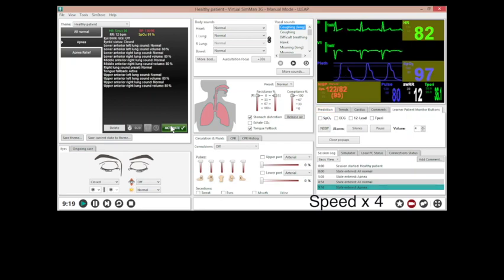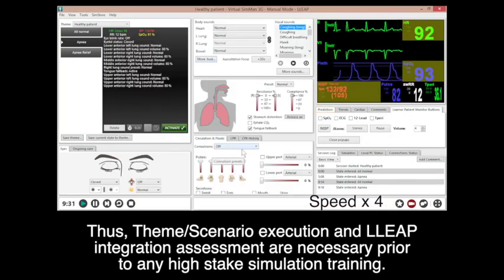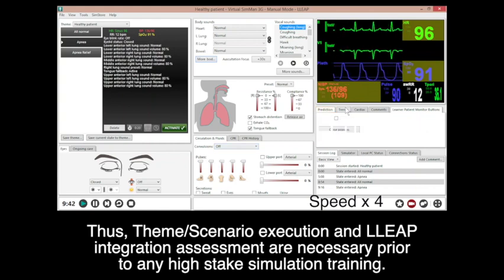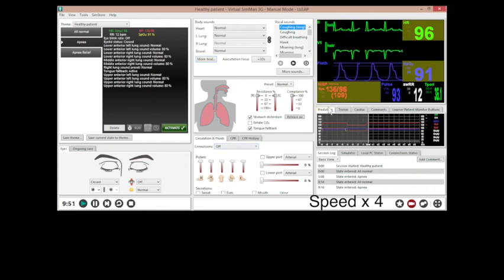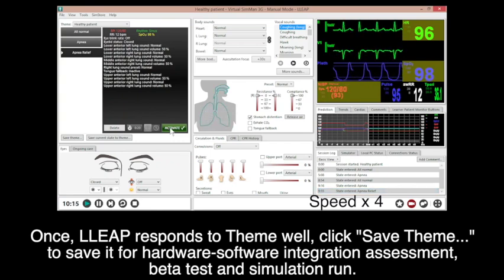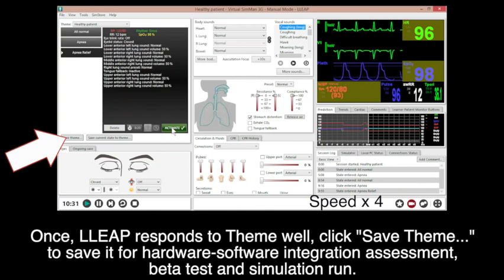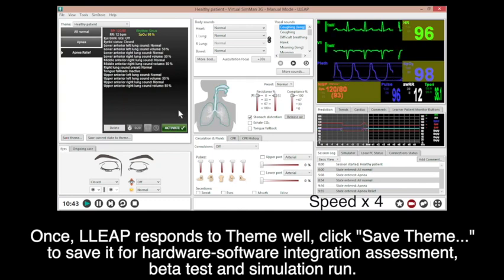Thus, theme and scenario executions and LLEAP integration assessment are necessary prior to any high-stakes simulation training. Once the theme is ready, click save theme to save it for hardware-software integration assessment, beta test, and simulation run.